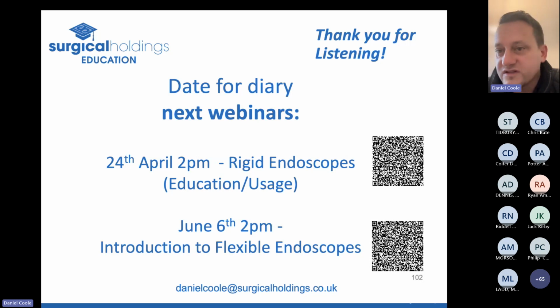And Solicity's also asked, does refurbishment come under remanufacturing? No, it doesn't. We're not fully refurbishing the device. We're not taking off the manufacturer's marks. In the case I'm talking generally about what we do, we're retaining those marks. We're ensuring that the device is following the original OEM specification.